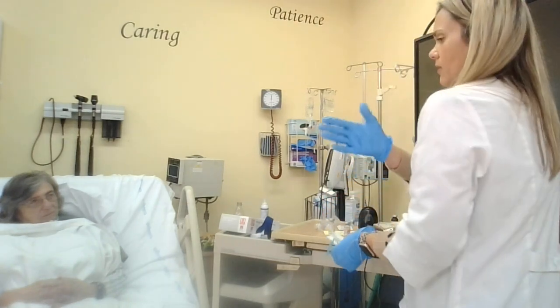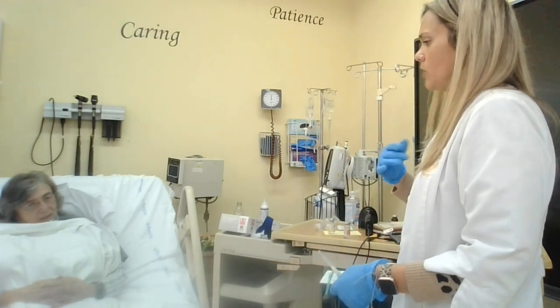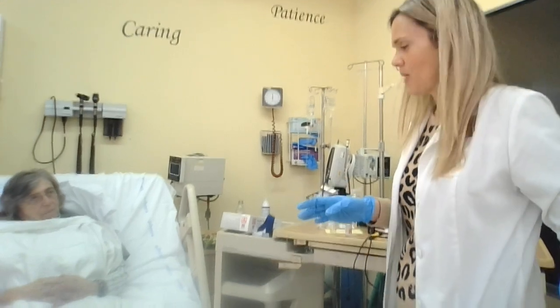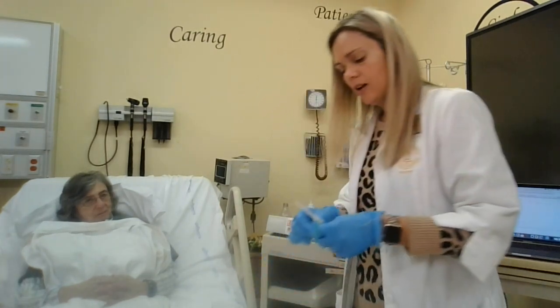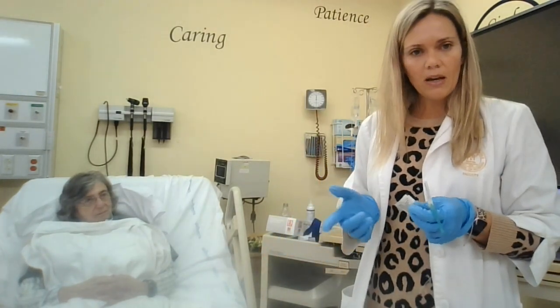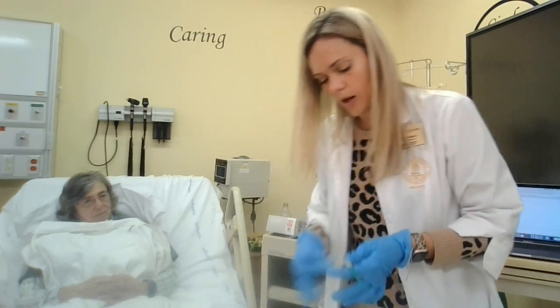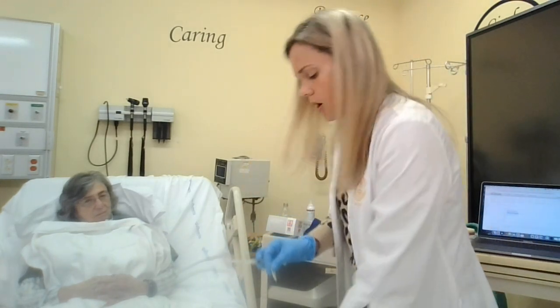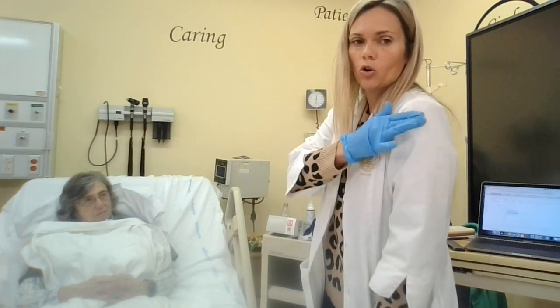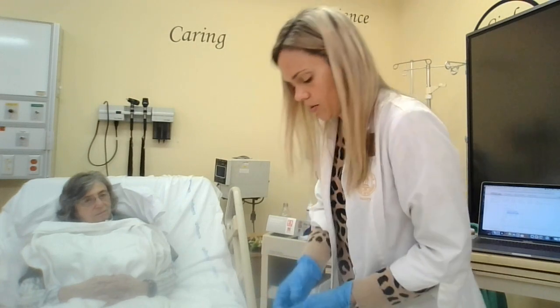Now, typically, I like to give immunizations in the deltoid muscle. You could do vastus lateralis for kids, but is it okay if we do it in your arm? Yes. Do you have a preference whether we use your left arm or your right arm? We're on my left side. On your left side? Perfect. Okay. So for this one, depending on your facility, you may be aspirating or may not. We'll pretend that we're at Northeast Georgia, where in our policy for immunizations, we're not going to be aspirating. We will Z-track, which means you're going to slide the tissue over, so I'll show that when we do it. To find the deltoid, remember, feel the acromion process, and it's 2 to 3 fingers or 1.5 to 2 inches below. So we'll give it right in that area right there.